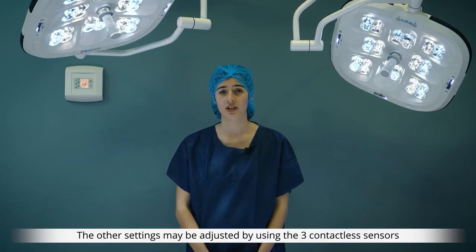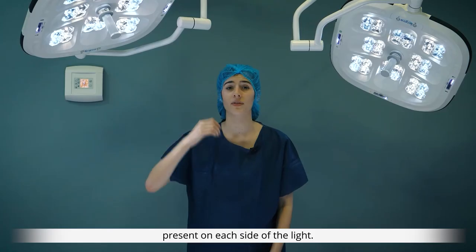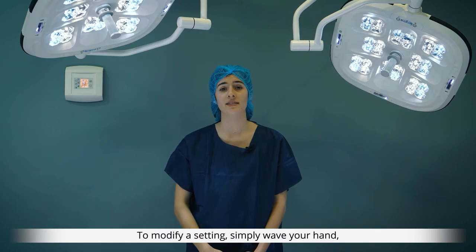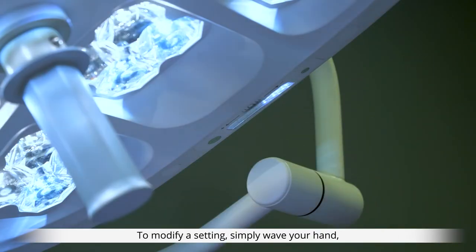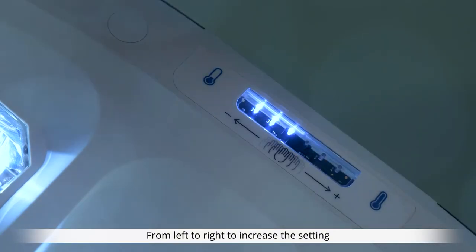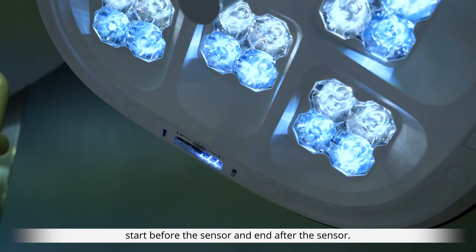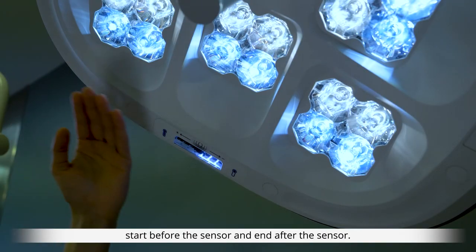The other settings may be adjusted by using the three contactless sensors present on each side of the light. To modify a setting, simply wave your hand about five centimeters from the sensor — from left to right to increase the setting and from right to left to reduce the setting. For perfect detection, the movement of your hand should be wide: start before the sensor and end after the sensor.